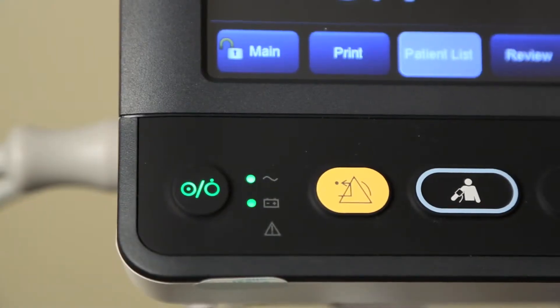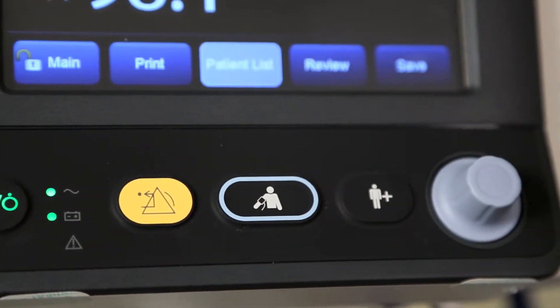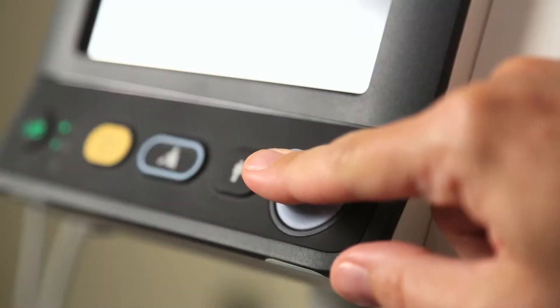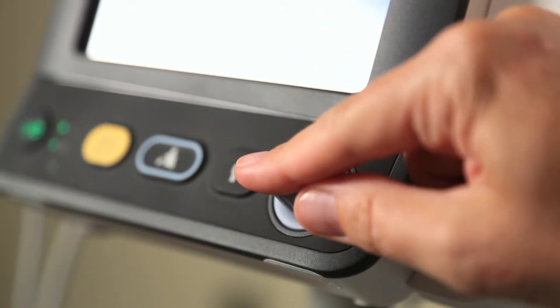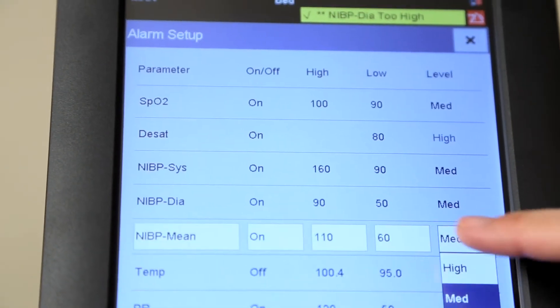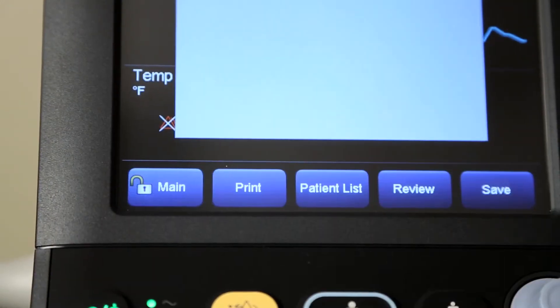A hard key is a physical key on the monitoring device, such as the alarm reset hard key and admit patient hard key. The gray knob on the front panel of the monitor can move the cursor by turning or can select an item by being pressed. You can also use the touch screen to select screen items by pressing them directly on the monitor's screen.